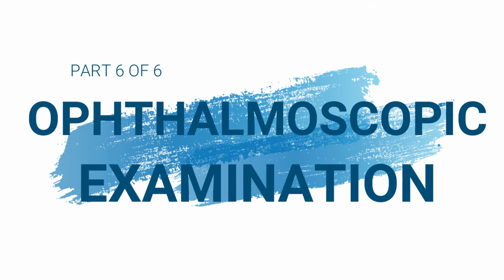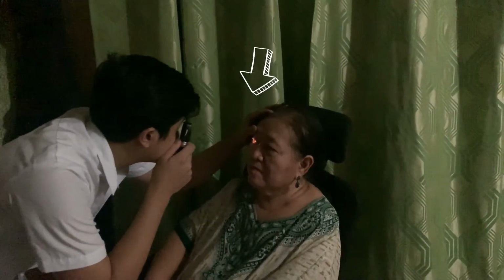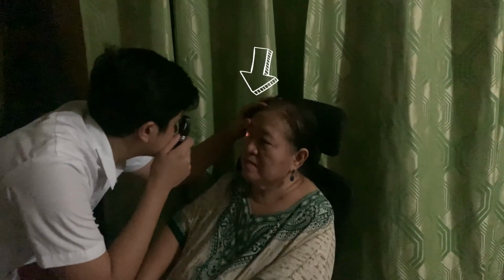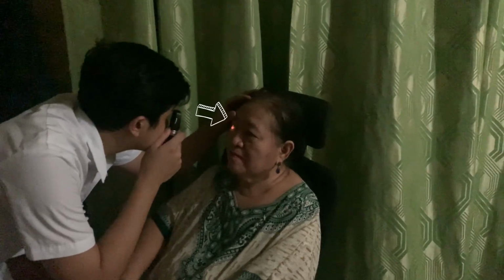Ophthalmoscope examination. Instruct the patient to fix their eyes on a distant point throughout the exam and to try not to move their eyes. Hold the ophthalmoscope with your right hand when examining the patient's right eye and the left hand for the left eye, such that your middle finger is resting on the lower front aspect of the head of the ophthalmoscope. Place your left hand on the patient's forehead with the left thumb over the patient's right eyebrow to assist stability. Apply a gentle upward traction on the top eyelid with the left thumb.